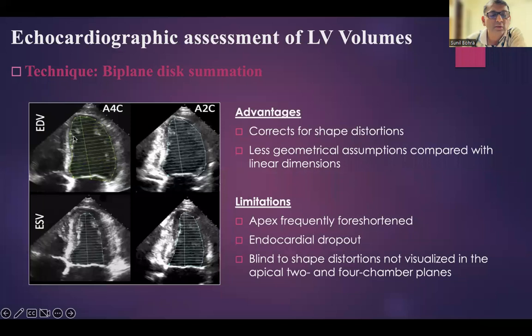So here we can see a lot of trabeculation. Here very clearly they have pushed the trabeculations into the cavity, and then they've taken the actual tracing. And similarly here you can see the papillary muscle. You should not trace it like this. You should not come like this. You should cut off the papillary muscle and you take a linear tracing. And then once you reach the lateral mitral annulus, then there is a closure line which happens.